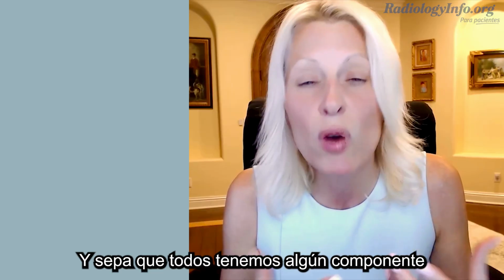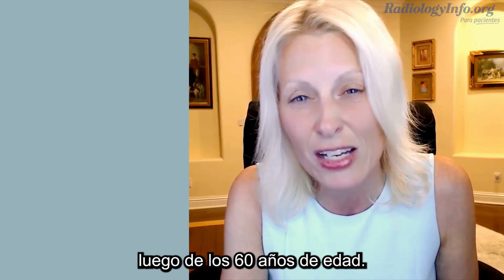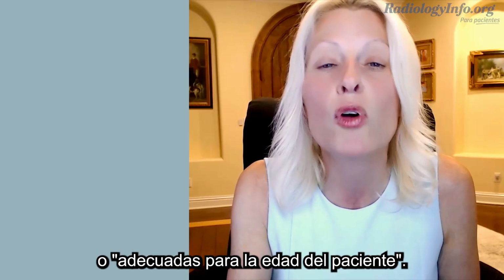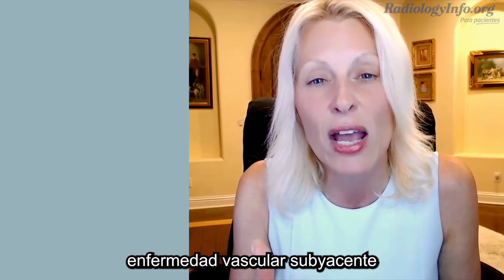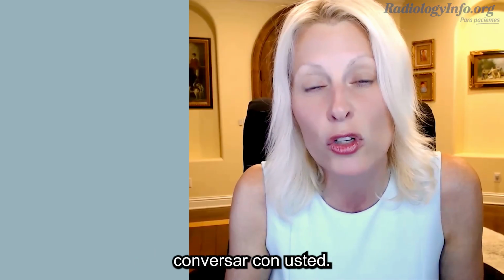Just know that everyone has some component of microvascular ischemic disease for the most part after the age of 60 or so. If it's mild, you might see wording like commensurate with age or appropriate for patient age. If it's more moderate or severe, that may be an indication that there might be some underlying vascular disease related to high blood pressure or high cholesterol that your doctor may talk to you about.